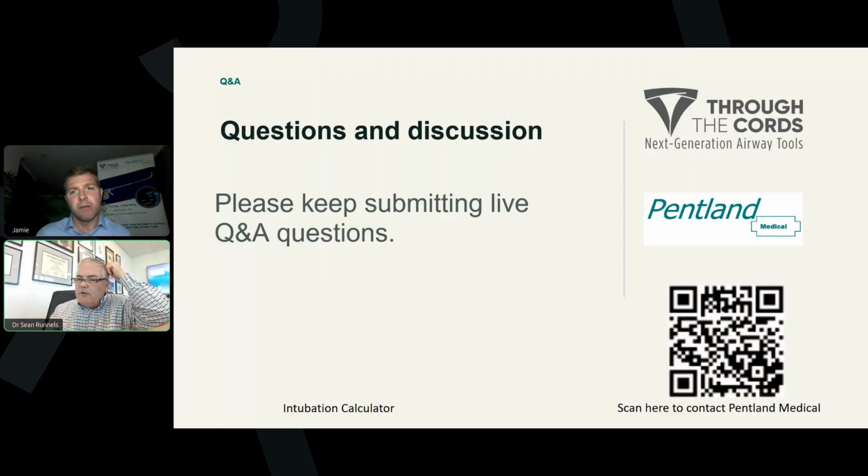So tracheal trauma is rare. Do you have any evidence demonstrating that the TCI reduces it? We do not. Tracheal trauma, as you said, is very rare. When you have a rare event, what you do is you look upstream of the problem and say, well, what is the thing that might happen upstream that we can measure because it's happening more frequently? But if we can reduce that, then we should reduce trauma.